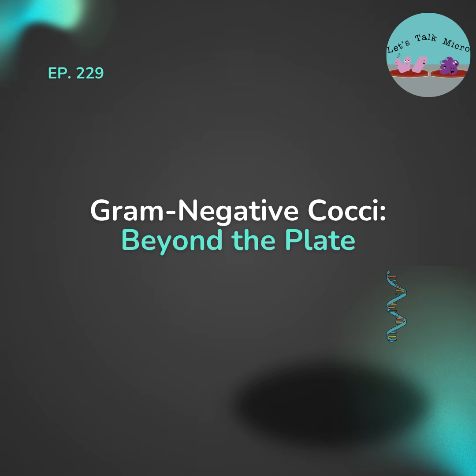And with this type of culture, you get a chocolate plate and a modified Thayer Martin. Now remember, just because something is growing on modified Thayer Martin, it does not mean that it is Neisseria gonorrhoeae or Neisseria meningitidis. The gram stain is always your best friend. If you perform one and see gram-negative cocci, you still need to sub it to media where you can properly identify it. And that brings us to today's episode, in which I am going to be mentioning some instruments and tests, and it does not mean that I am endorsing these products, but they are commonly used in the lab.